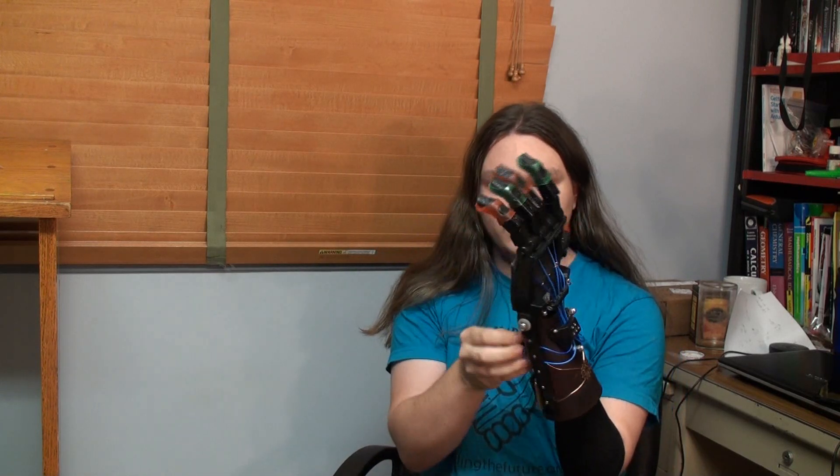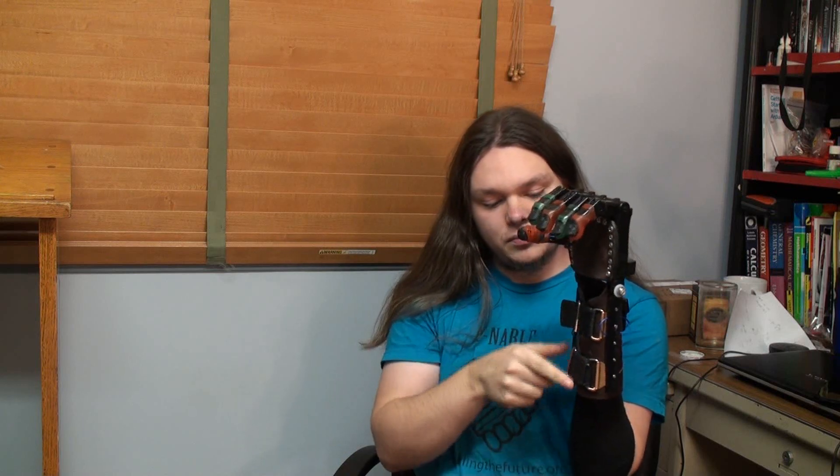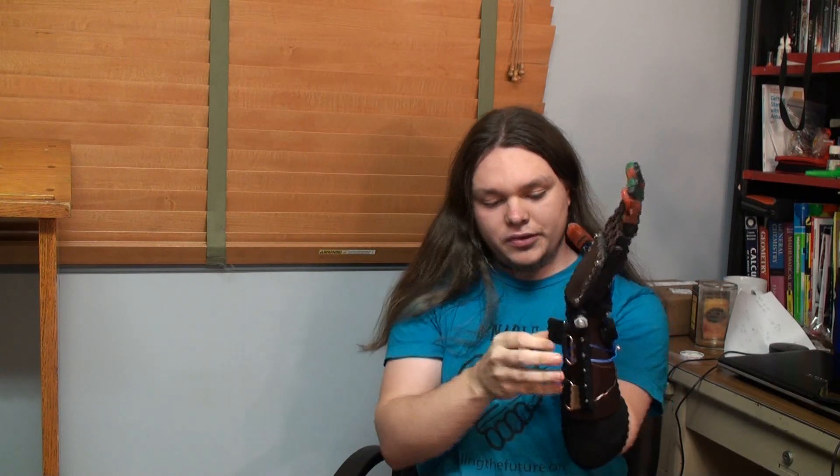I don't even need to unfasten both of them, just the top. Pop this in, close it back up, and I'm hooked up.